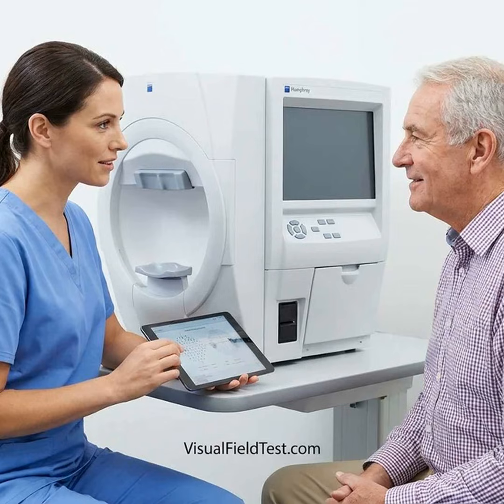Teach back and short practice questions. After a video or demonstration, the technician can ask the patient to explain the procedure in their own words. This is called teach back. Useful questions include: where will you look during the test? When should you press the button? What should you do if you do not see a light? Are you allowed to blink? What should you do if you become tired?